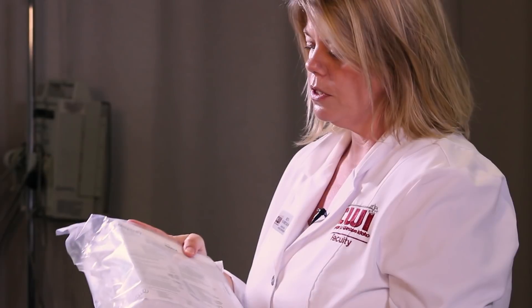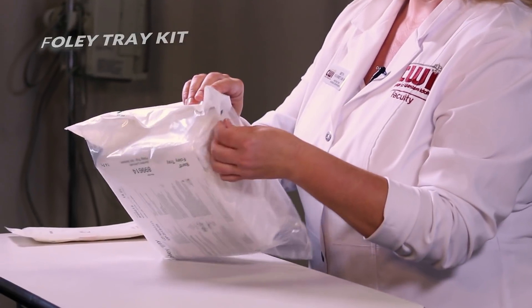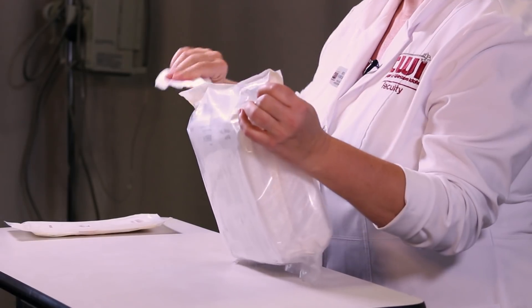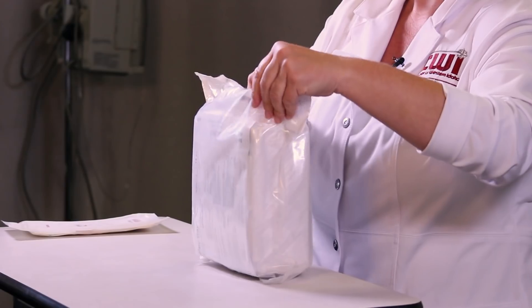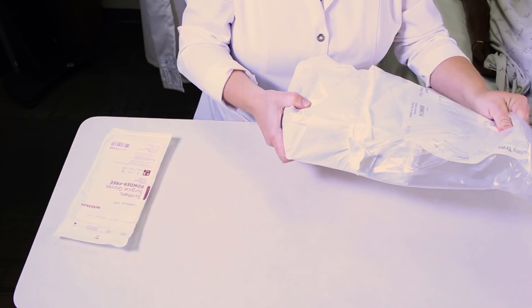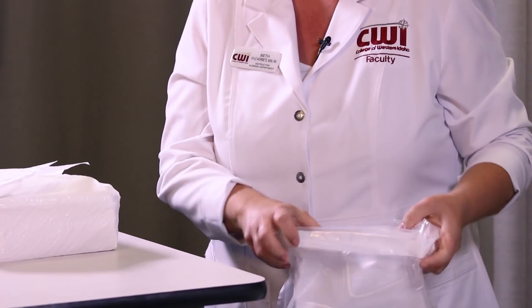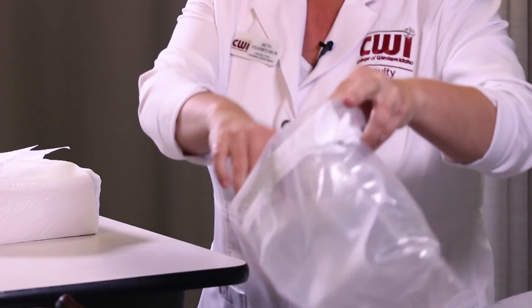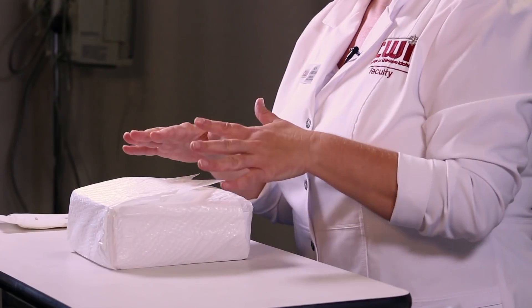The majority of hospitals and facilities have the Foley tray kits, which are very handy. They open at the back, the kit slides directly out, and then this portion — the outer plastic portion of the bag — can act as your garbage receptacle that you can set on the end of your bed. As you'll see, this is already within a drape, so this is your sterile field.